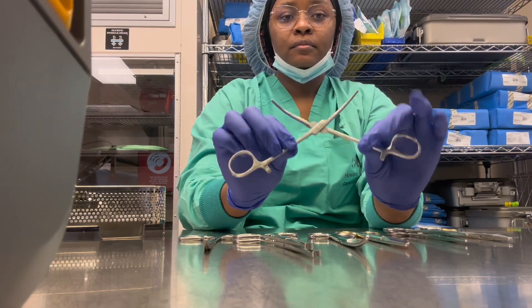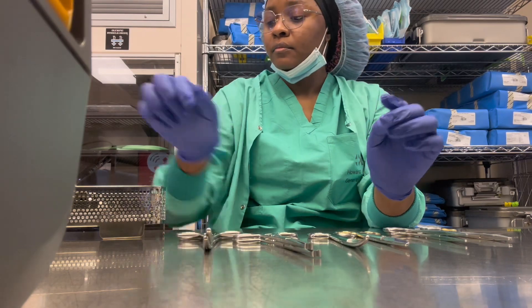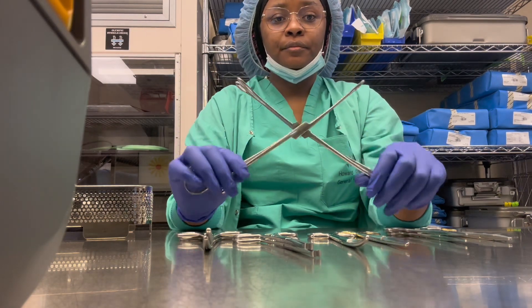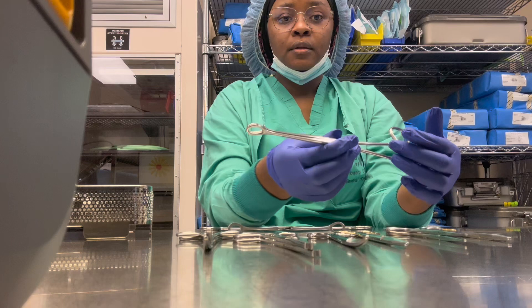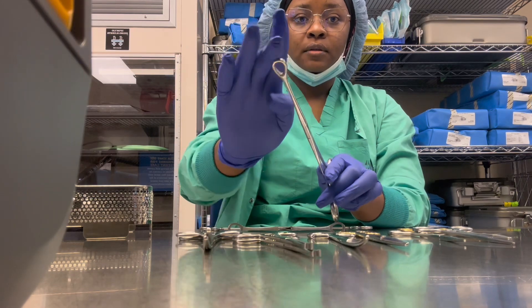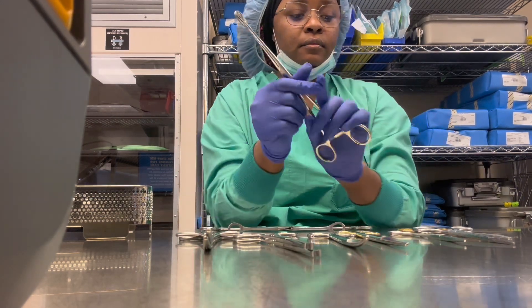For the budding set, two kellys go into this set. The next instrument is the sponge stick — this is the nine-inch. With the sponge stick, the distinction is that at the top it has a hole in between. Once you see that, you just know it's a sponge stick — the hole is a clear distinction.